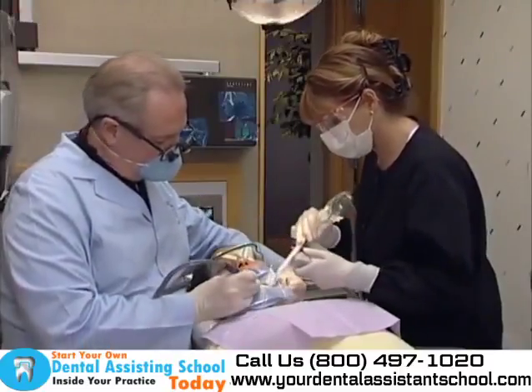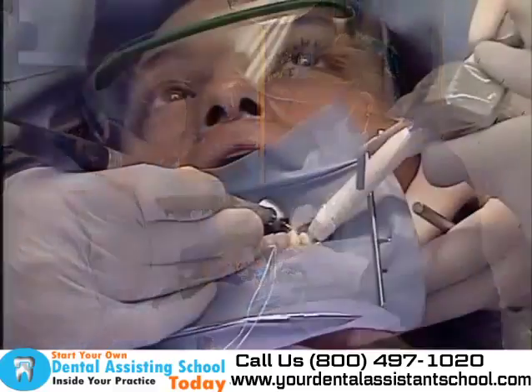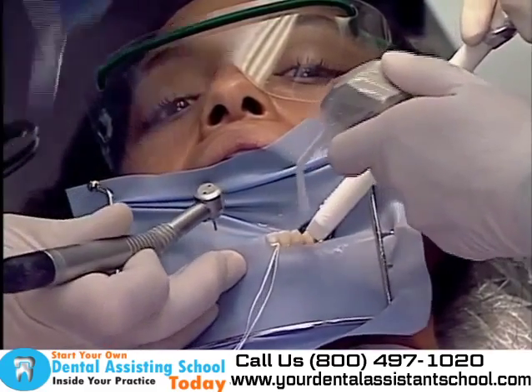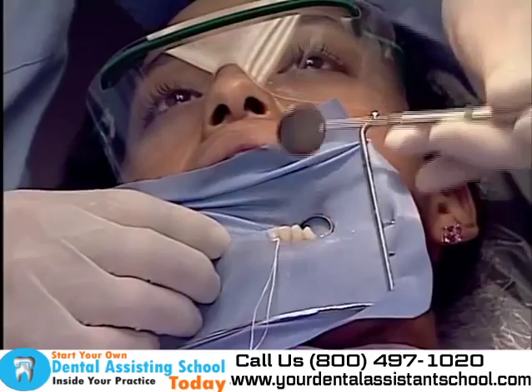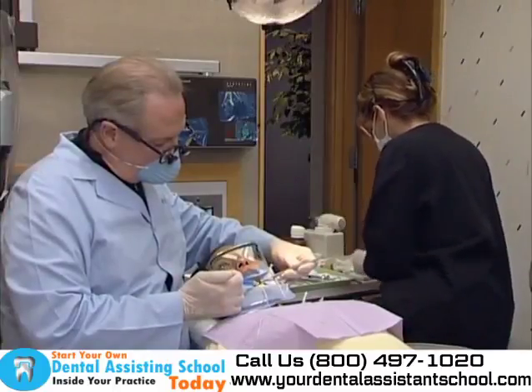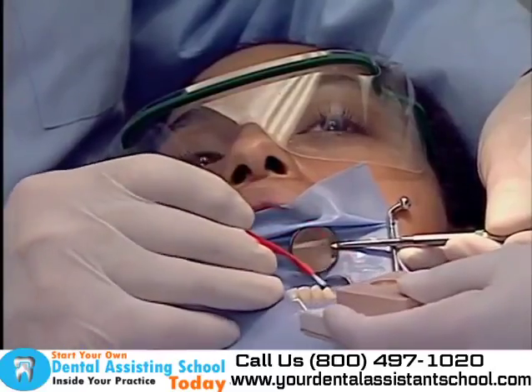The dentist uses a high-speed handpiece with a preparation burr to cut the tooth surface. As the procedure unfolds, the dental assistant should suction as needed using the high-volume evacuator, or HVE. This helps keep the area dry by removing saliva and debris from the mouth, which allows the dentist's field of vision to remain unobstructed and cuts down on spatter. An acid etching agent is then applied to the tooth in order to prepare the enamel surface. This causes irregularities in the tooth surface, allowing the bonding agent to function better. The bonding agent is then applied, and the tooth is ready to accept the composite resin.